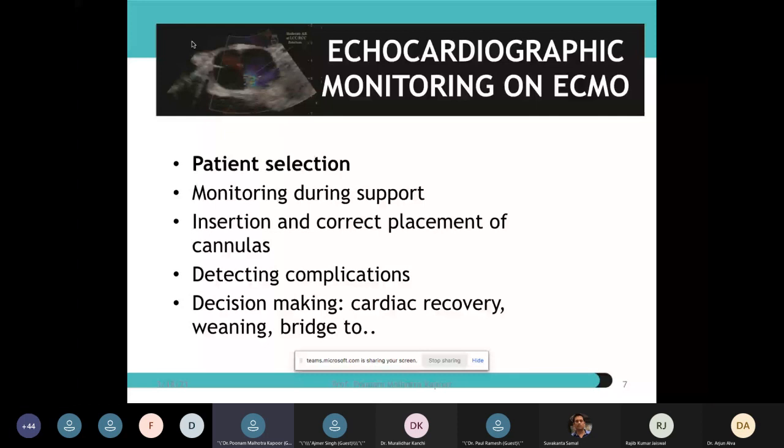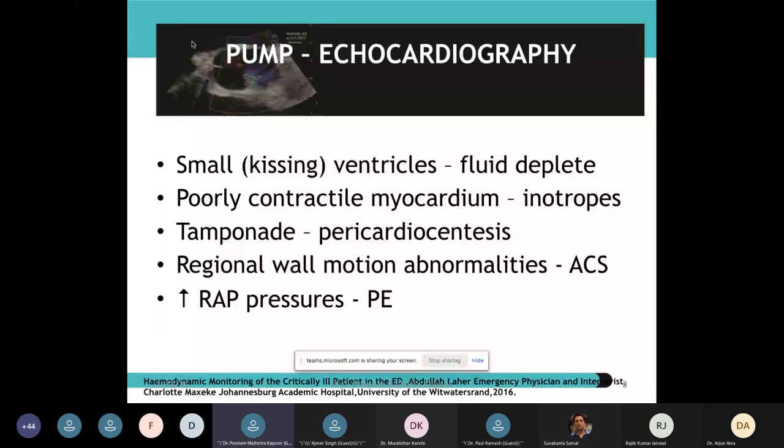So maybe a transgastric short axis mid-papillary view is what we need to tell us about hydration. We are all aware of it. It can easily be done through the transthoracic or the transesophageal route.